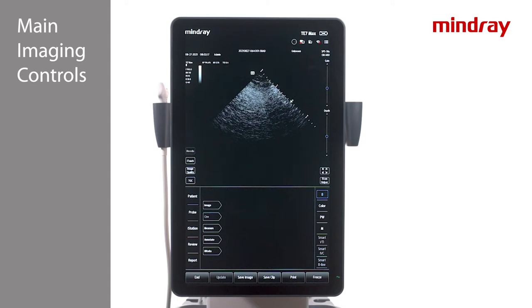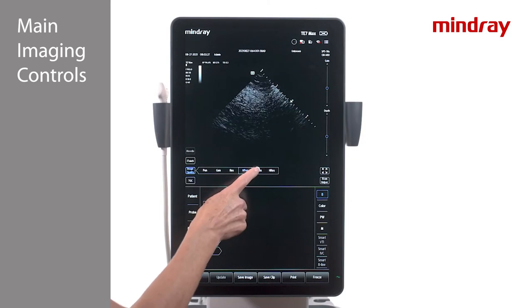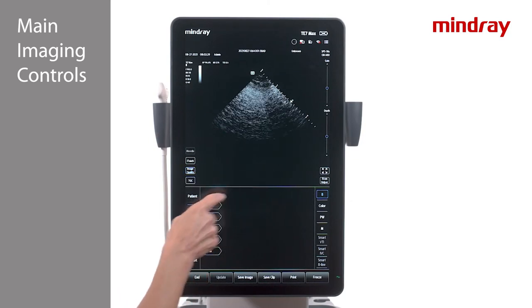On the left side of the touch screen is the IQ key, which is where frequency can be adjusted. There are six frequencies to choose from: three fundamental frequencies and three harmonic frequencies. Most of the time frequency will not need to be changed, since the optimal frequency is applied in the exam preset.